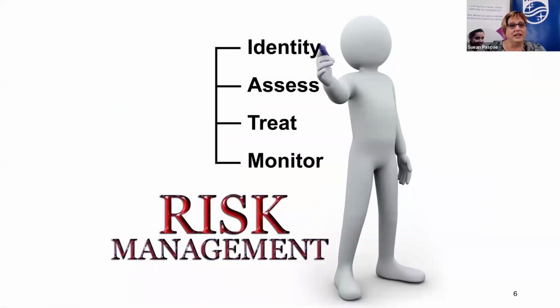The initial imaging is the first step in disease management. Identifying that there is a stone and its potential sequelae, you can assess the size of that stone, its location, and it helps you to figure out what the risk is regarding the passage of stone and whether it may or may not need surgical intervention.